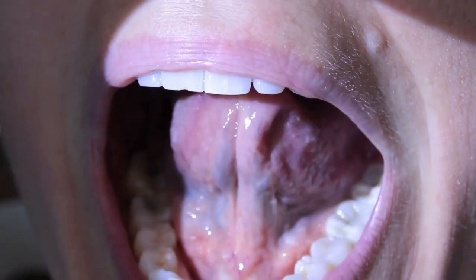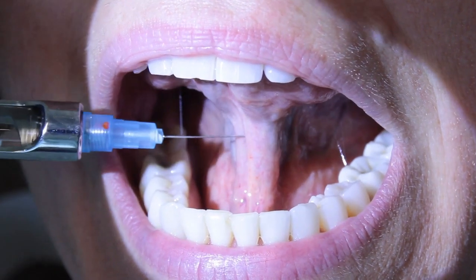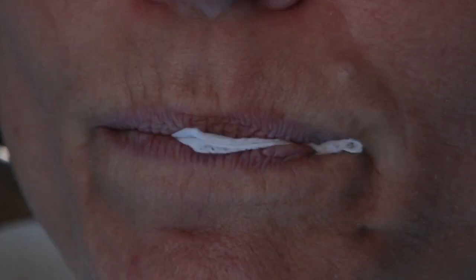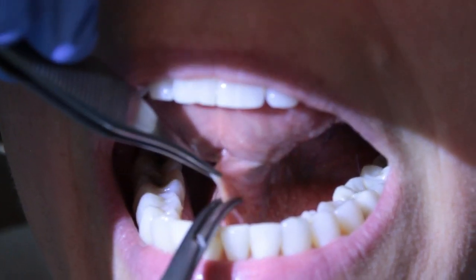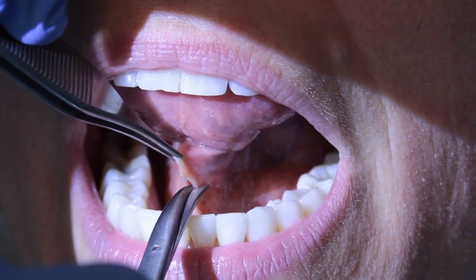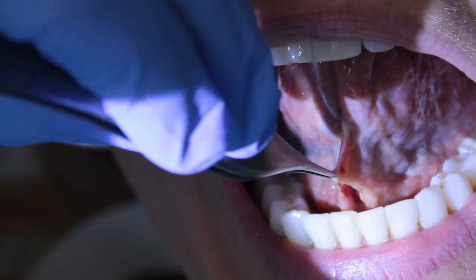You see how it's asymmetric here? See that? Lift it up. Are you feeling this? No. Keep it up. Are you feeling this at all? Relax. Primarily mucosal.